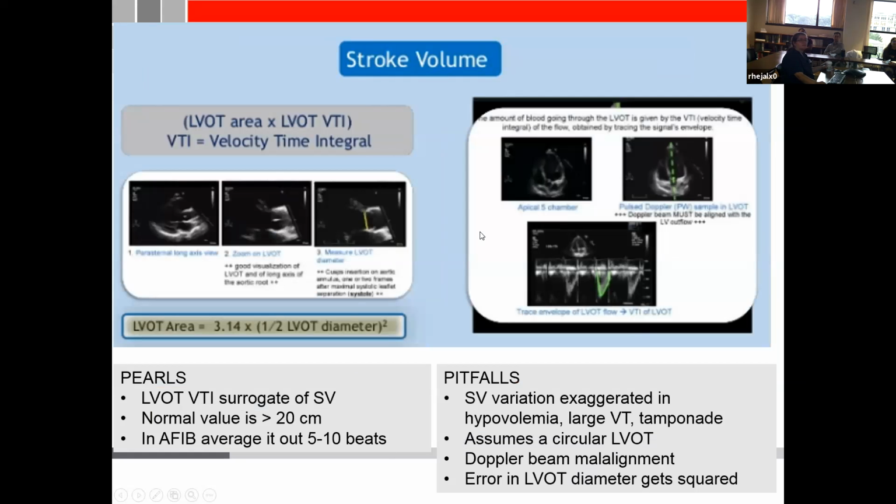It's the same. If you're sitting there and you're trying to calculate the stroke volume by transthoracic echo, you can do it the same way. It just takes a little bit of a longer time. Currently, on our machine, you have to do it manually in the ICU. If I'm lucky, you'll get a newer one that will just identify it for you and calculate it automatically.